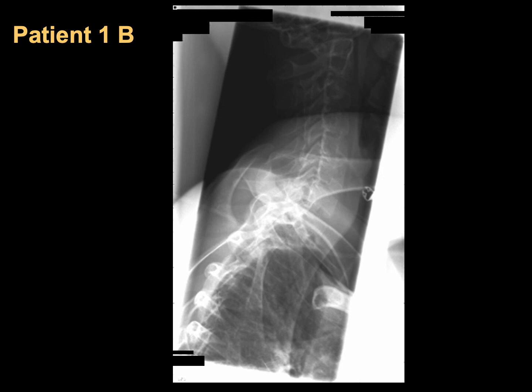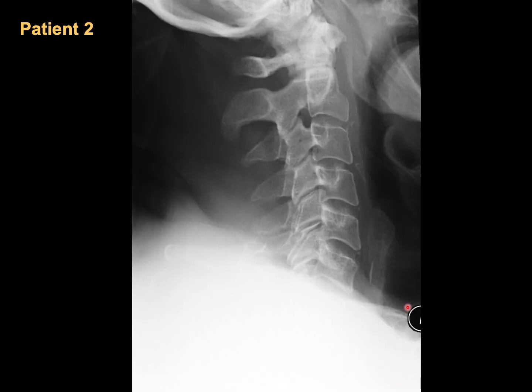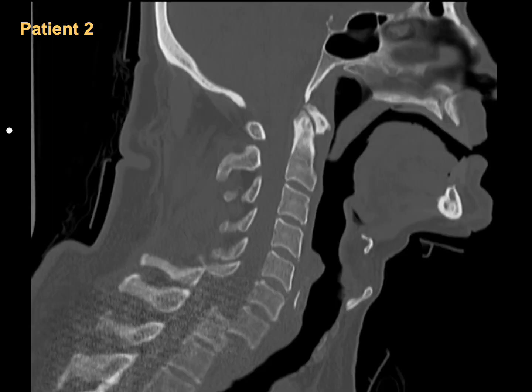If you judge the X-ray as normal based only on what you have, you may miss an important unstable fracture or subluxation and neurological deficit. Be sure you have a complete view of the cervical spine including the upper border of T1.